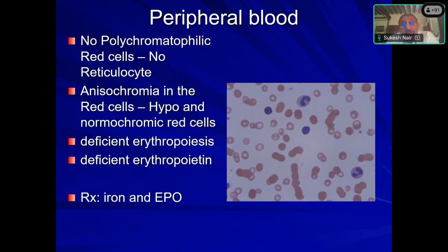So yes, you can give a lot of information to the nephrologist, telling them, you have iron deficient erythropoiesis, you have to give iron, but it looks like your patient also is not having adequate erythropoietin. The nephrologist said, no, the patient is already on erythropoietin. Okay, maybe you have to increase the dose. It makes a huge impact on the nephrologist, because the nephrologist will listen to you and increase the dose of erythropoietin, and when the hemoglobin goes up, he will respect you for the rest of your life.